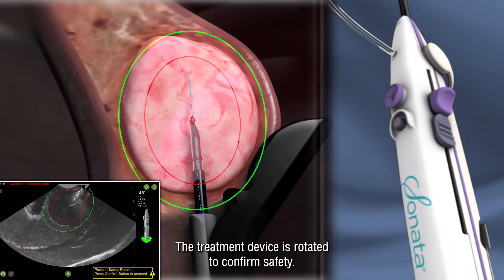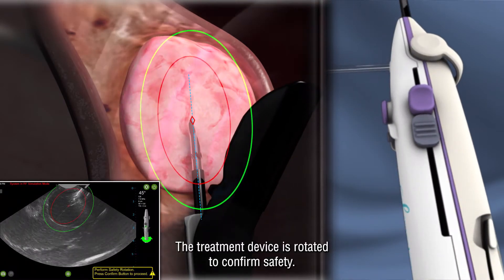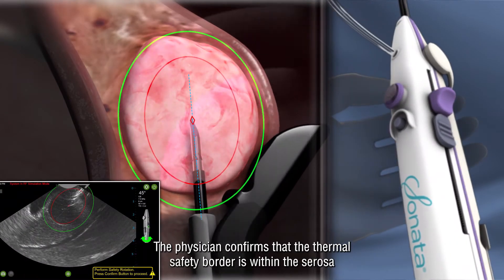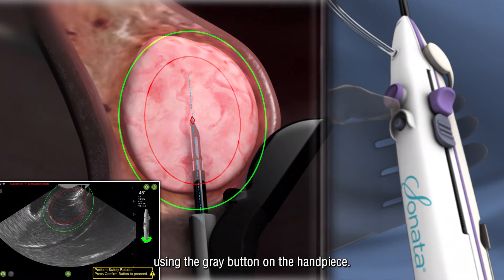The treatment device is rotated to confirm safety. The physician confirms that the thermal safety border is within the serosa using the gray button on the handpiece.